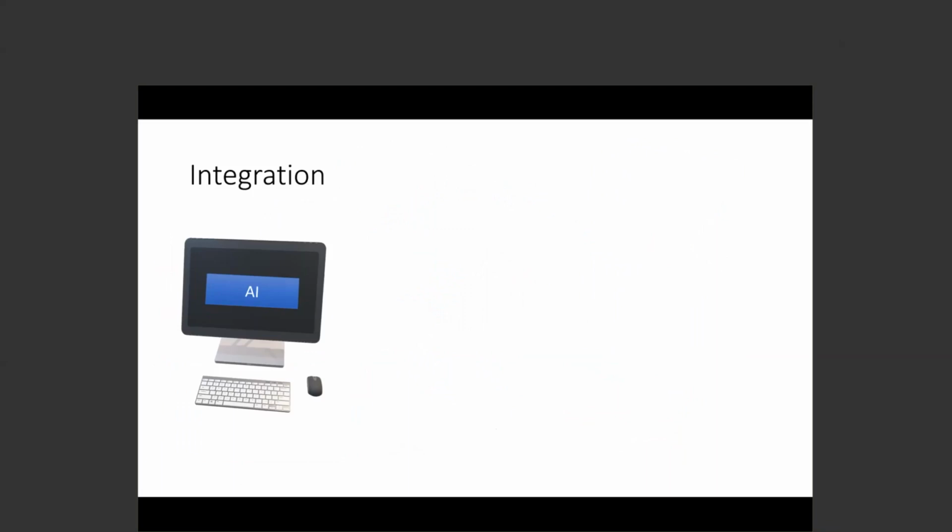The other part of the integration, which is more on the front end, this is the ideal scenario. In the same place where I'm reviewing the images, I can click a button or right-click and then get to the AI results right there.